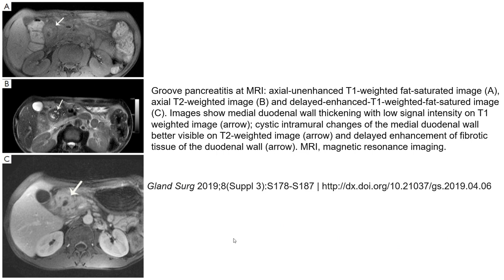Groove pancreatitis on MRI. Image A is the axial fat-suppressed T1-weighted image, image B is the axial T2-weighted image, and image C is the delayed enhanced T1-weighted image. The duodenal wall shows low signal intensity on T1-weighted imaging — arrow indicated — with cystic intramural changes in the duodenal wall better visible on T2-weighted imaging — arrow indicated — and delayed enhancement of fibrotic tissue in the duodenal wall — arrow indicated.